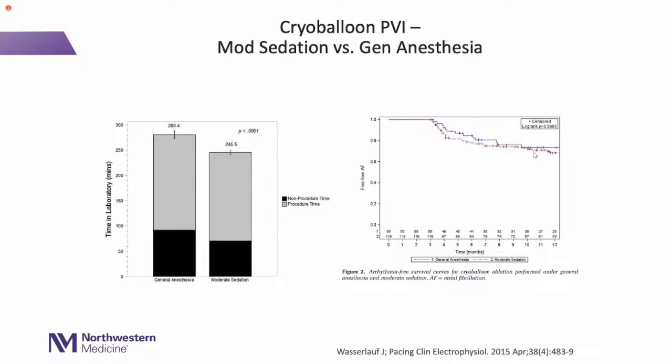Most of our group now is doing most of our cryoballoon AF ablations with general anesthesia. I've kind of gone back and forth. Right now I do them almost all with general anesthesia, to eliminate some of those outlier patients who are difficult to sedate. I think the trigger for me was when the guy was moving around so much his foot was hitting the fluoro control, so he was going LAO, RAO with his foot, and I'm like, that's enough of this. But we had historical comparisons, and some of us still do moderate sedation.